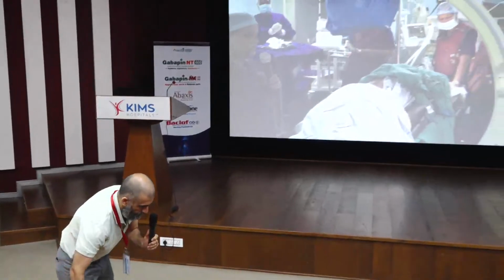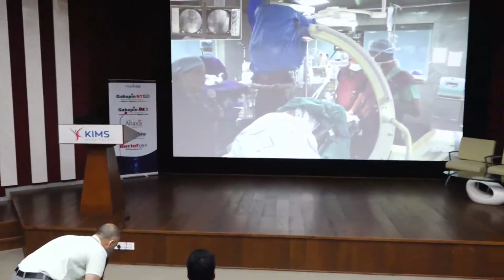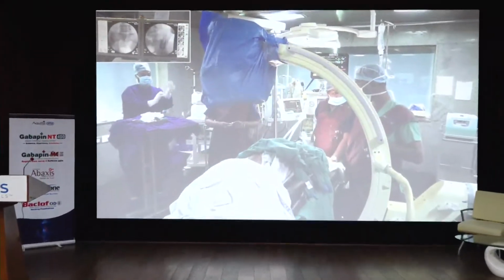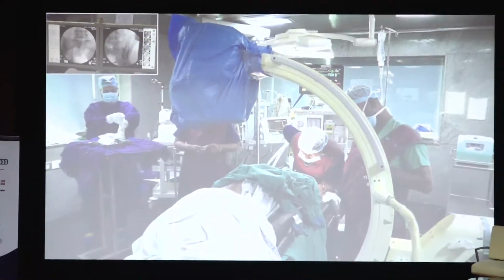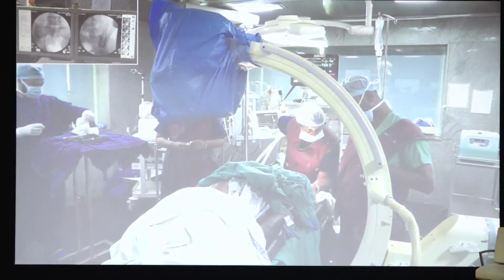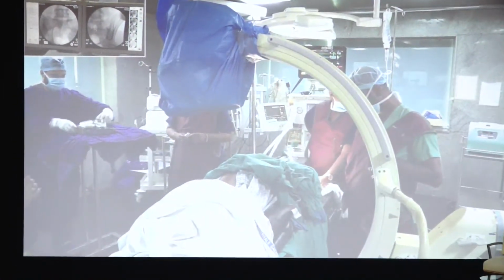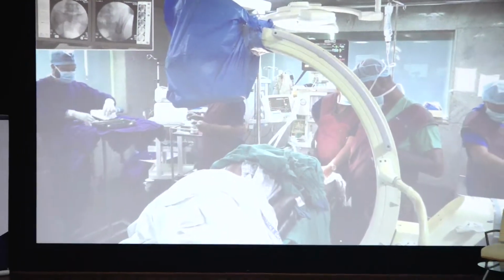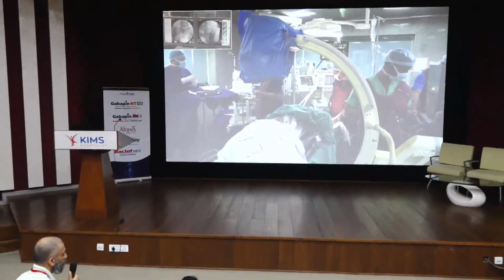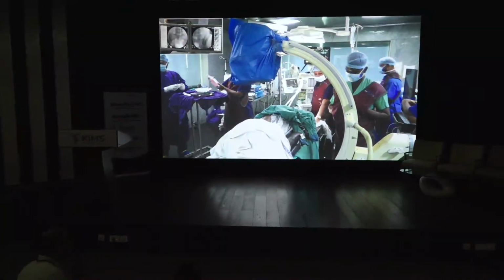Yeah, I think now they are ready. We just want to combine it with both ultrasound and fluoro guidance. Yes, sir. So just connecting the ultrasound machine in a couple of minutes. One thing, in the last case they talked about putting in pillows. Pillows are put just to take care of the lumbar lordosis, so that the entry and everything becomes easy.